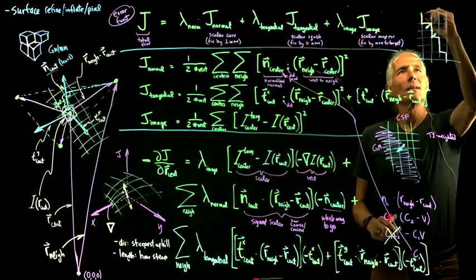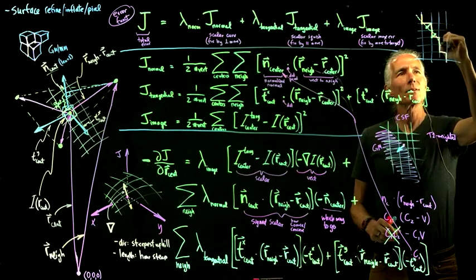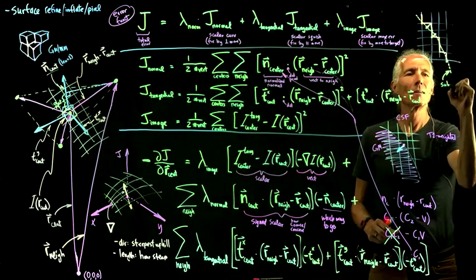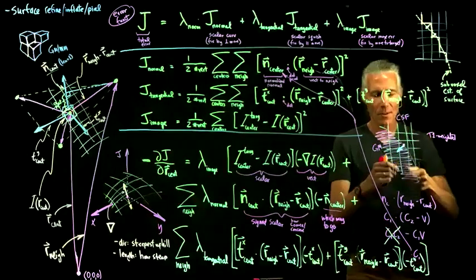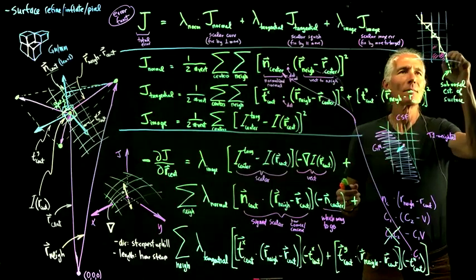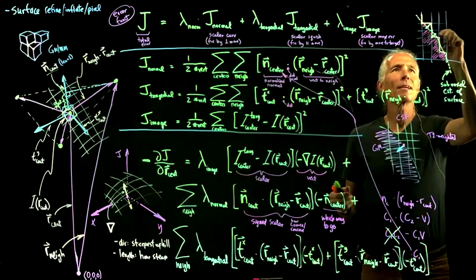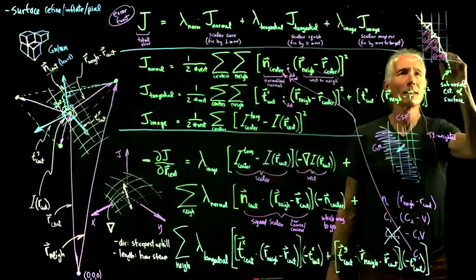And so what will happen is that you'll end up with this subvoxel estimate of where the surface is, something like that. So this is a better subvoxel estimate of the surface. Whereas our original data will be coarse. It will just say like white matter, white matter, white matter, white matter. But our new surface will be more accurate. And so that's how we get sort of a nice refined surface.